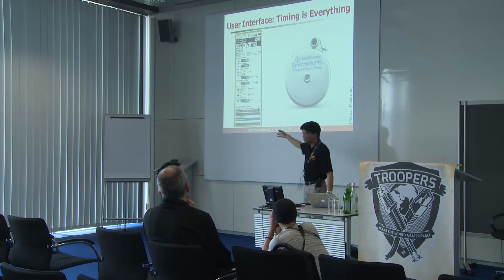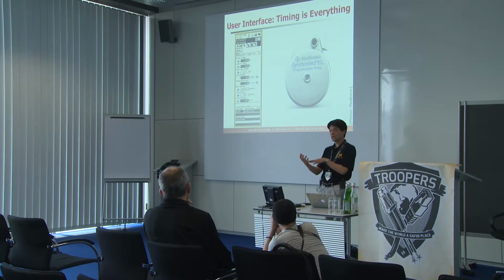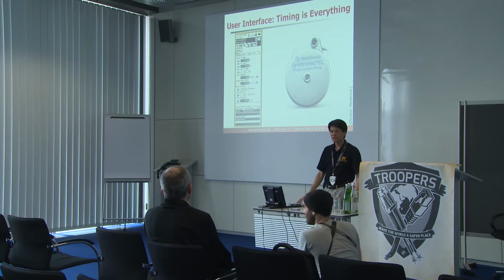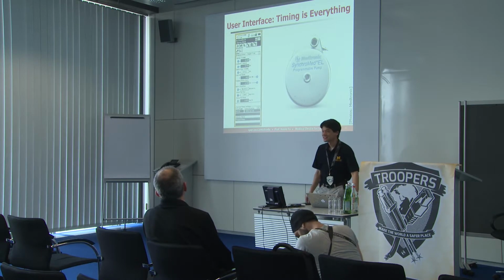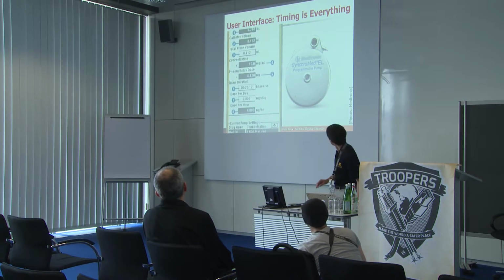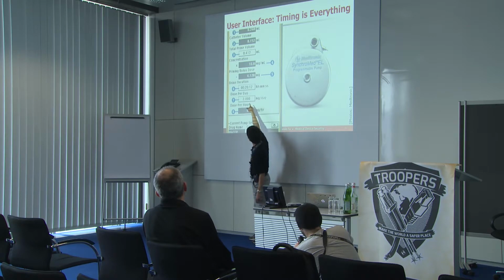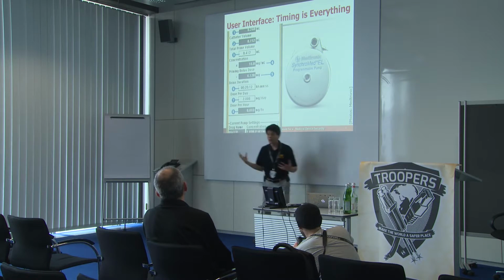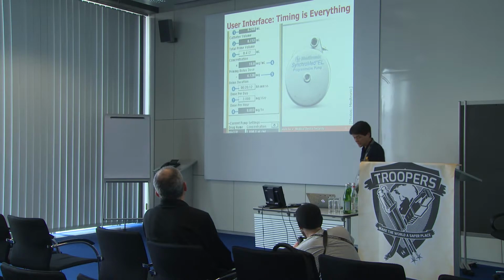And then on the left is the user interface that the healthcare professional uses to type in the drug delivery rates. So can anyone see what is the size of the bolus? How much drug goes into the body and for how long? It's kind of hard to see, so let's zoom in there. If you can see, there's this thing called bolus duration, and it says we're going to do it for 20 minutes and 12 seconds for a fixed amount of drug. So that pump is then going to act on that command.